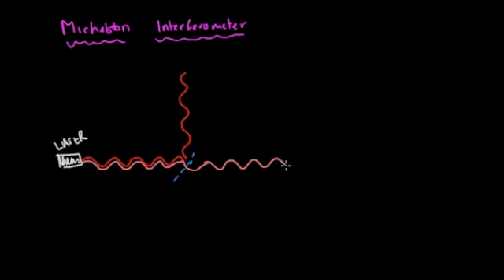And this light is incident upon another mirror, and the light that travels upward strikes another mirror and is then reflected back downwards, and as it travels back down, it passes straight through this half mirror and proceeds downwards.